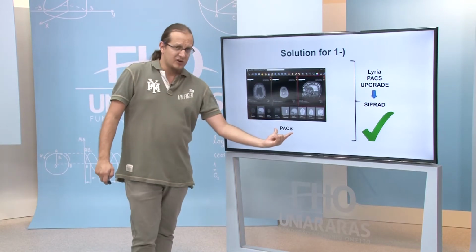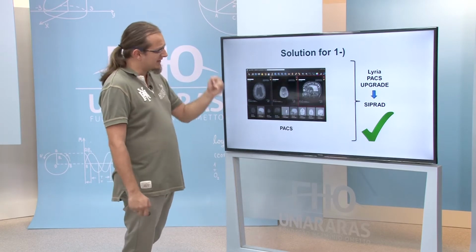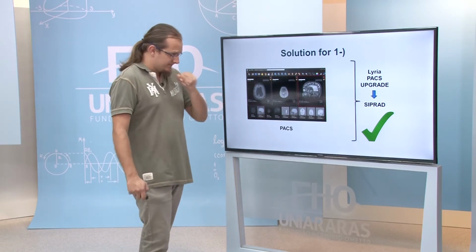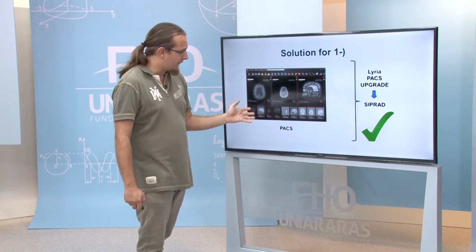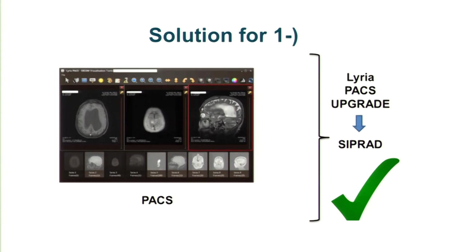The Picture Archive Communication System, PACS, has DICOM communication, DICOM images and RT. This type of interface design is important to doctors drawing on personal computers and drawing regions of interest.